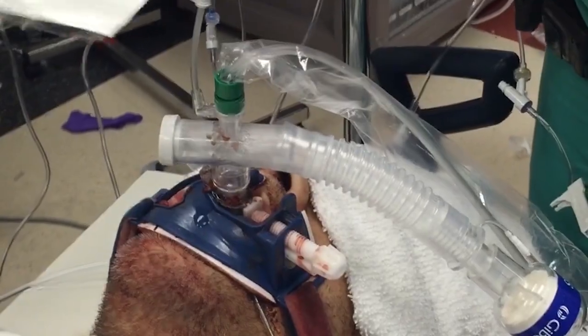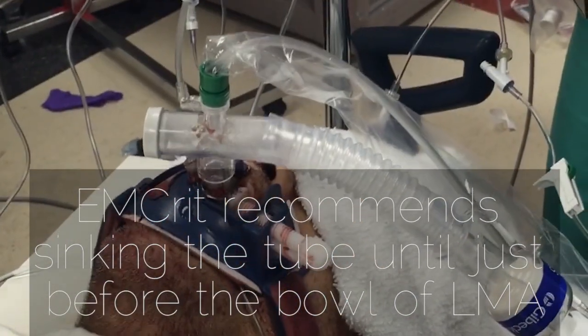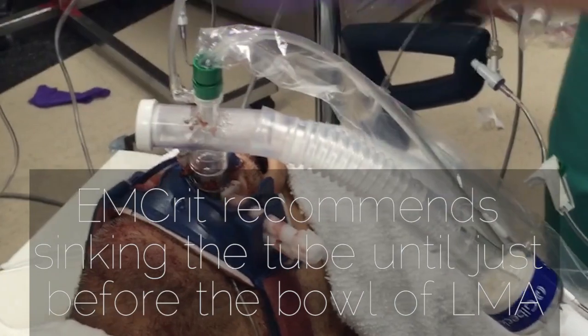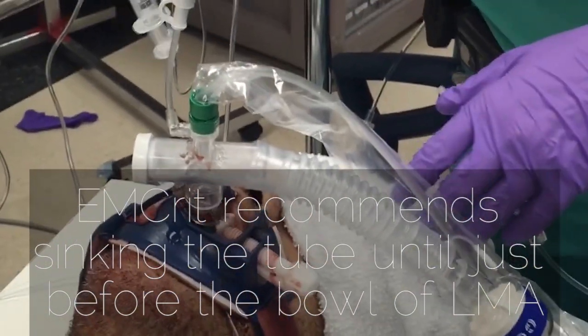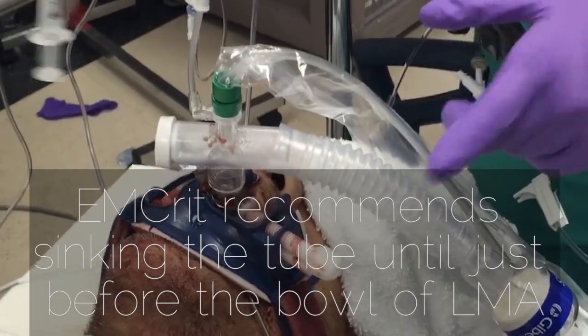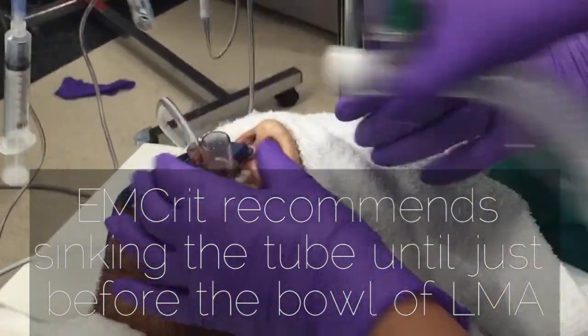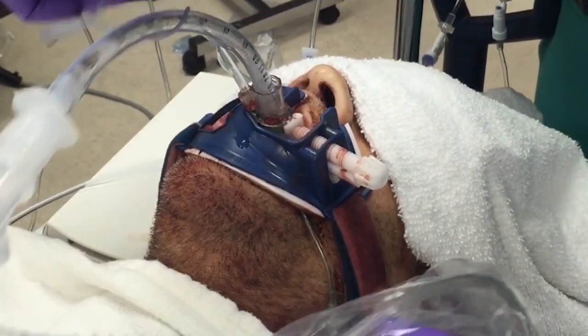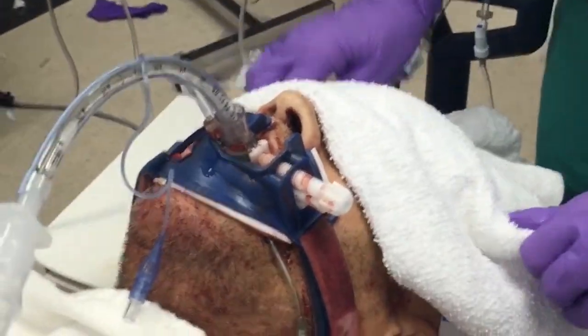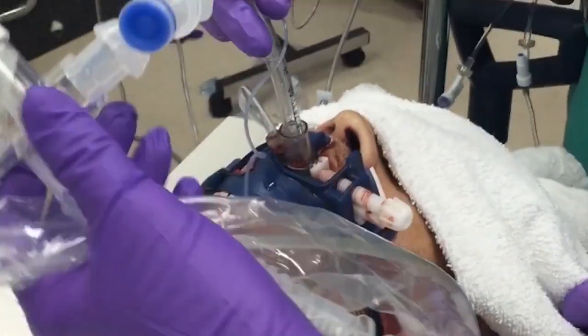How far do I advance the ET tube into the LMA? Probably about 2 to 3 inches in. You're going to create some dead space, but that's still going to ventilate him well. Go ahead and remove the vent, connect it back onto the bronc port adapter. Now you're ventilating him through this extra dead space.